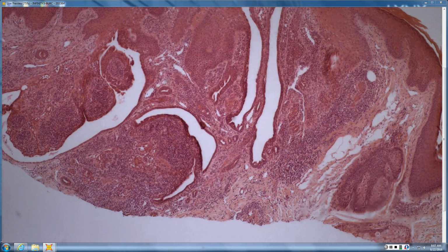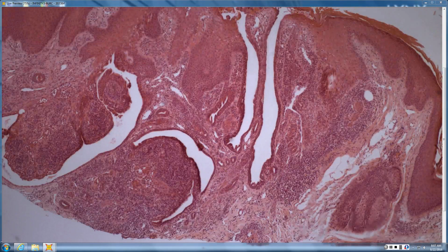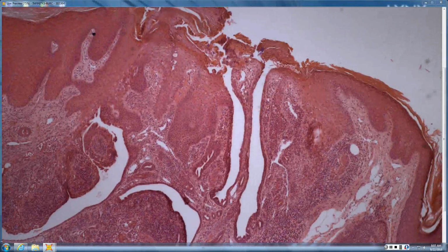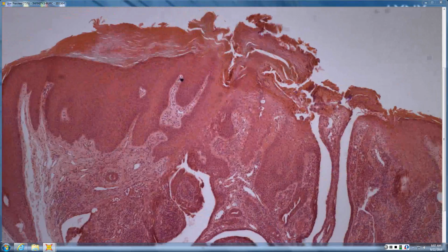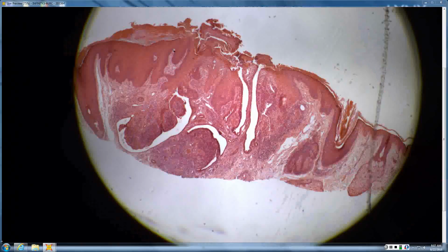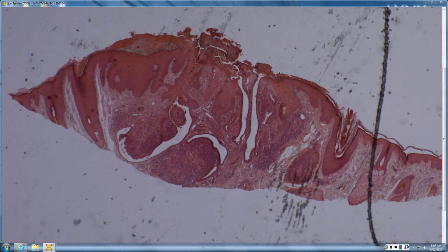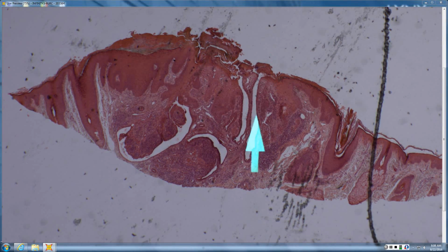Okay. I'm seeing a shave. Epidermis is a little thickened, and looks like there are maybe some kind of polygonal cells hanging off of it. However, it's more of a scanning view. I see more of this kind of system, almost like a fronds appearance, like fronds within spaces. And does it connect to the surface? Yes, it looks like it probably all would connect to the surface. So one could conceivably slide right into it.